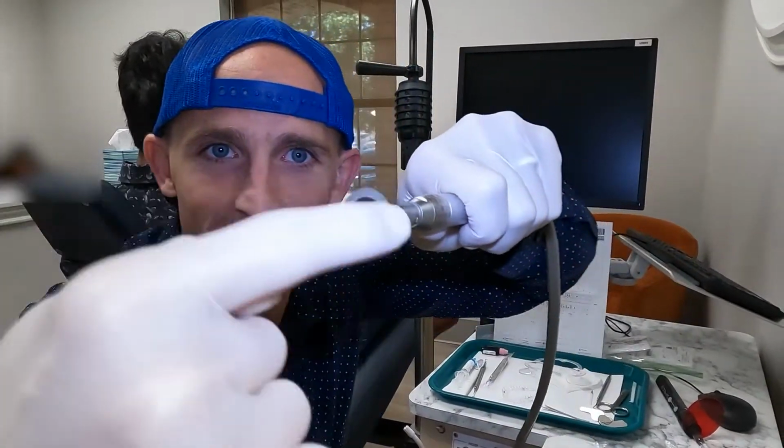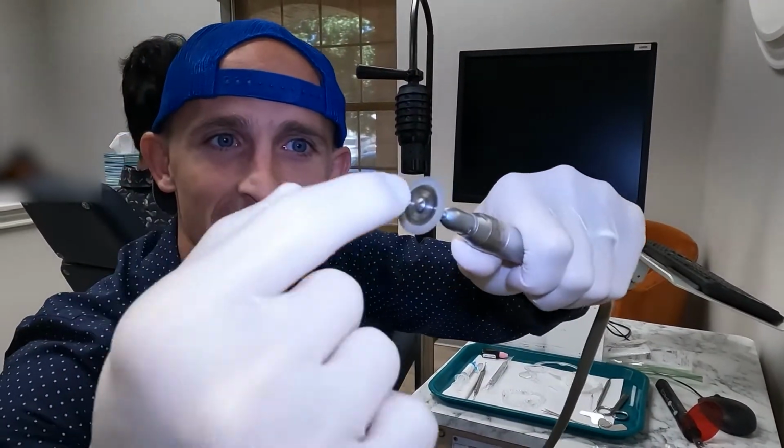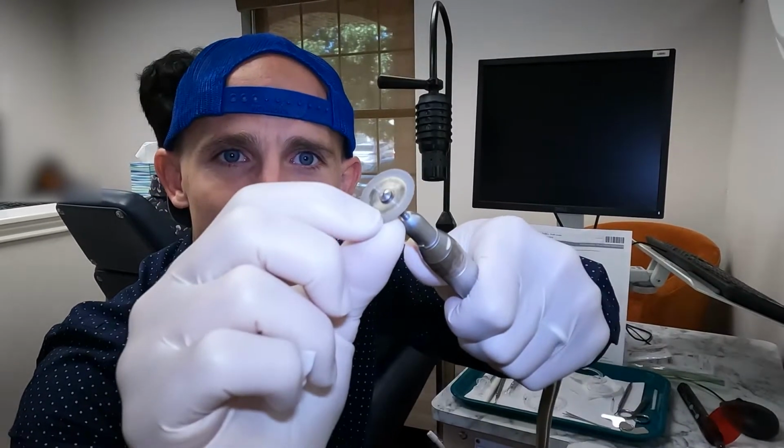This is our main tool for doing the shaving. It's a disc. You can see it's round. Okay, it's round, and it's got kind of a rough edge here on the corners and a rough edge on the inside. So ours is a double-sided disc, and you buzz that.